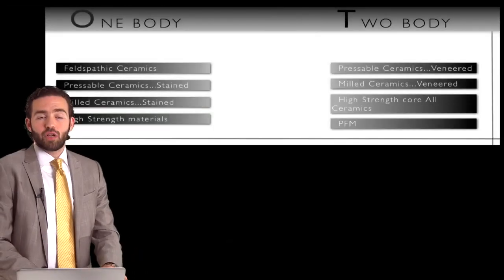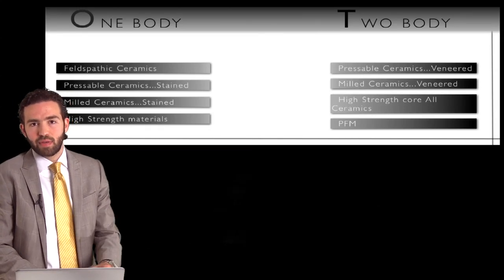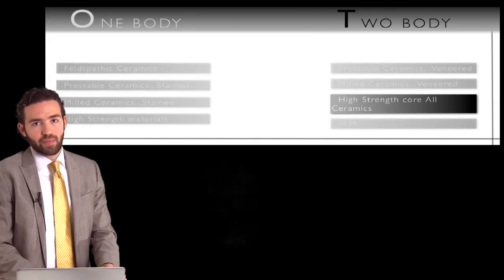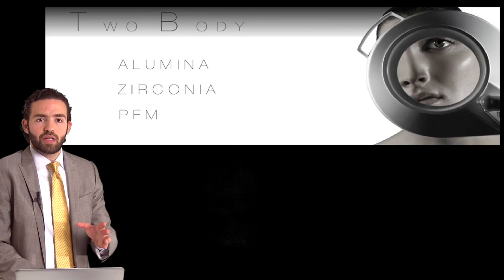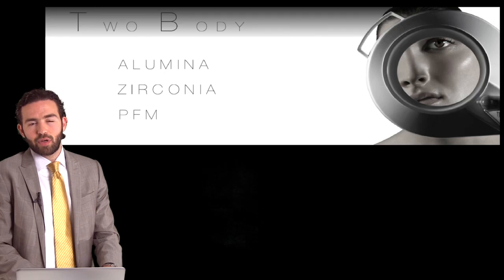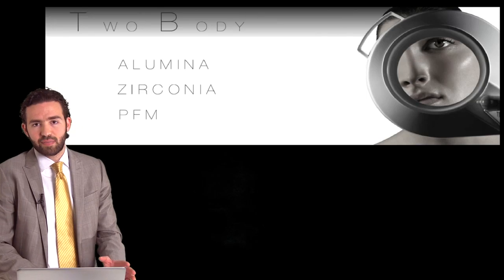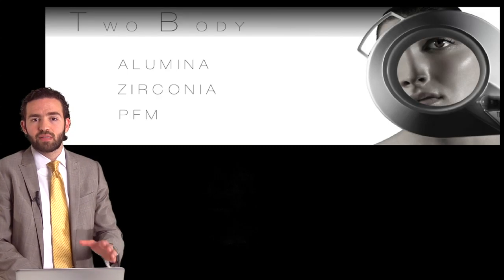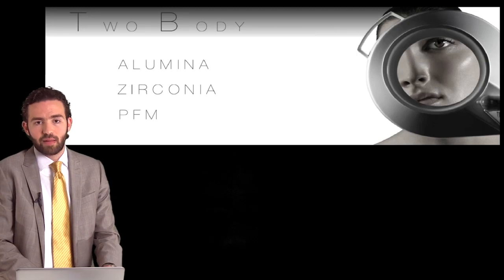So far we have covered all of the one-body group, and we're going to concentrate on the two-body group for the next few minutes, in particular the high-strength core all ceramics. What we mean by the two-body group, as we said earlier, is the alumina, the zirconia, and the PFM restorations. We're not going to go into porcelain fused to alumina because alumina really is not used that often nowadays in 2011, and most practitioners are heading towards porcelain fused to zirconia restorations and the good old porcelain fused to metal.